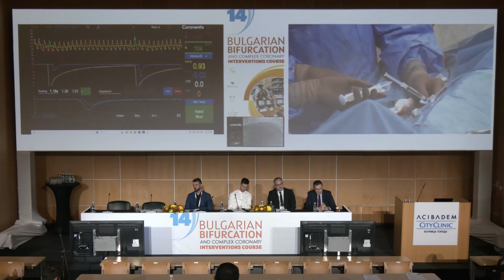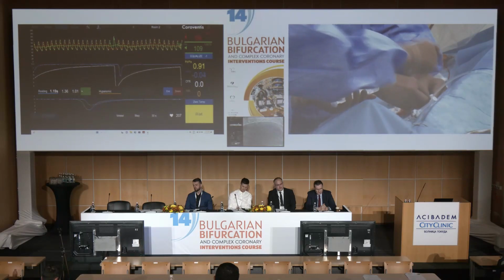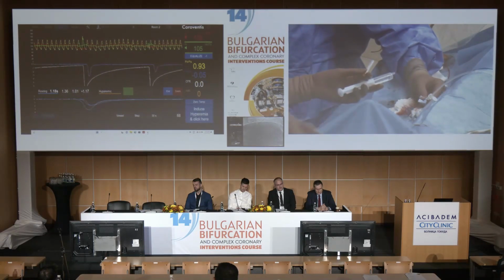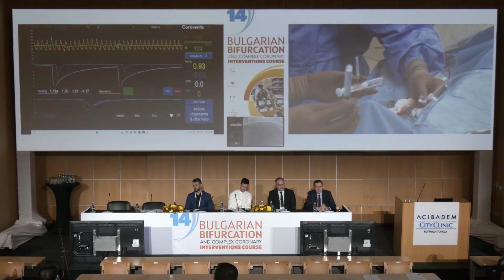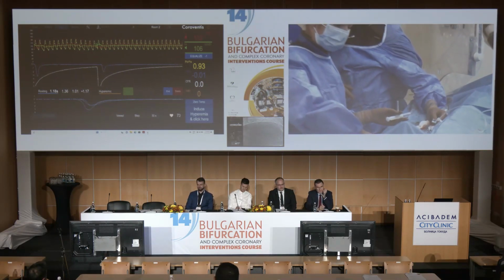Relatively close, reasonably close. Inject now, yes? Papaverine, prepare it. Okay. Not too fast, the papaverine, just to be prepared. And now we have, wait a minute, we have the 3 mean transit times, and the average is 1.18 seconds. The machine asks us now to induce hyperemia.